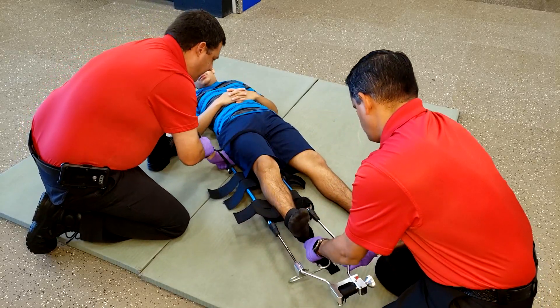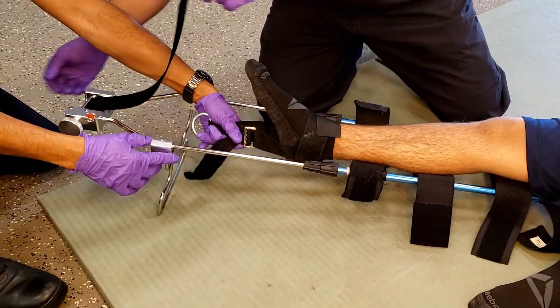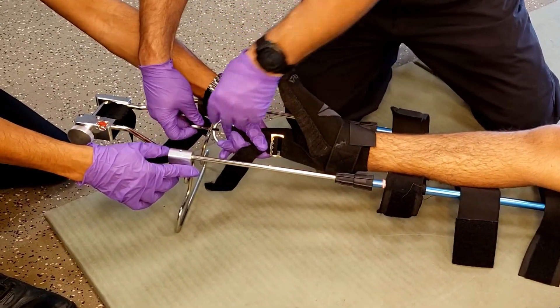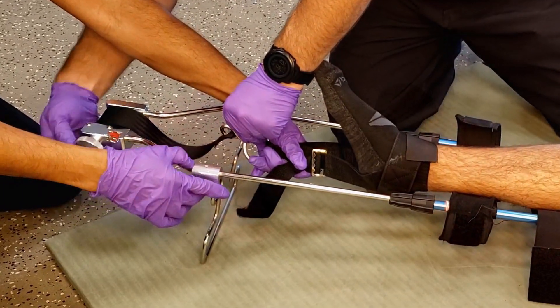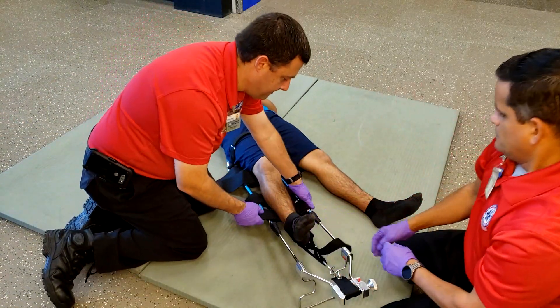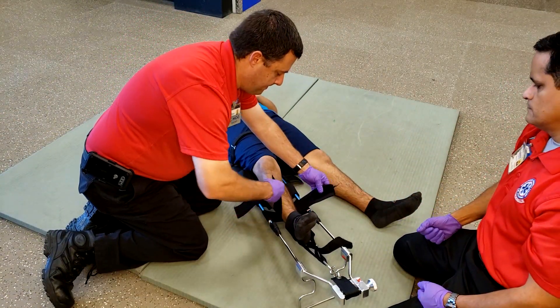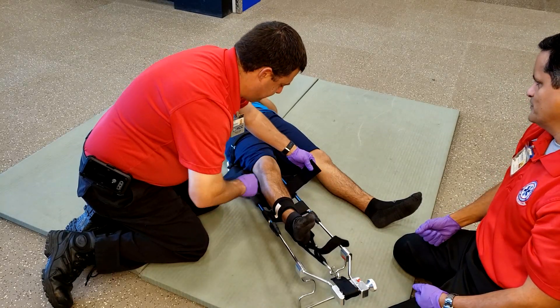Once it's in place, secure the ischial strap first. Next, secure the ankle strap to the winch and apply enough traction until the patient feels relief. Then secure the four straps starting from distal to proximal.